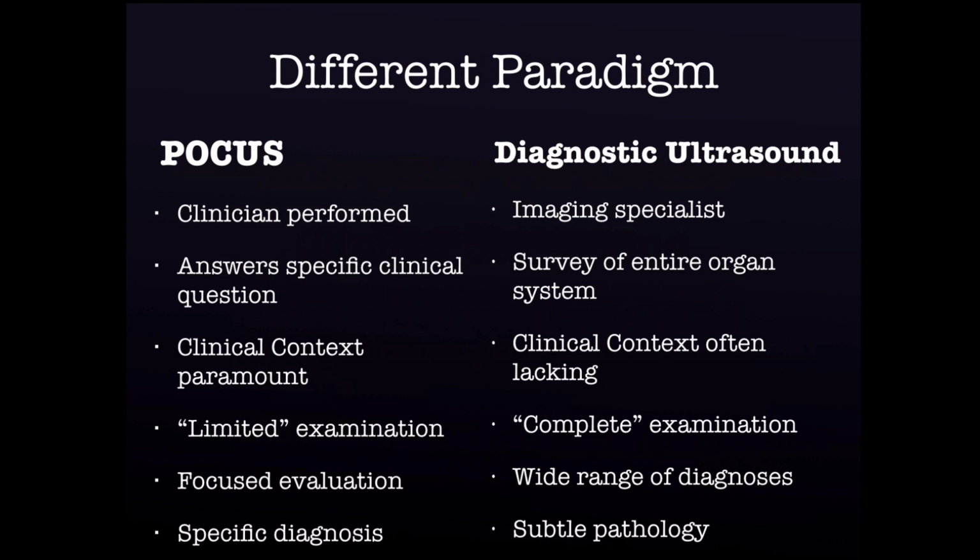All right? And if we don't use it that way, then we're blinding ourselves, and our ultrasound skills are not going to be as good. All right? So the radiologist is like that. They don't always know what's going on with the patient. We just put down on the requisition, abdominal pain. Well, that doesn't narrow it down.